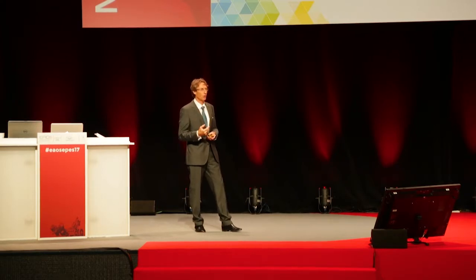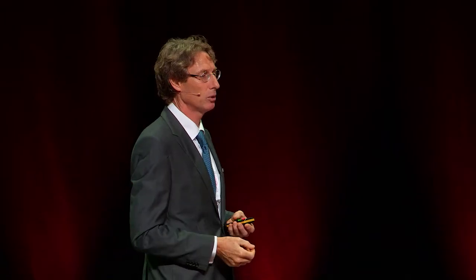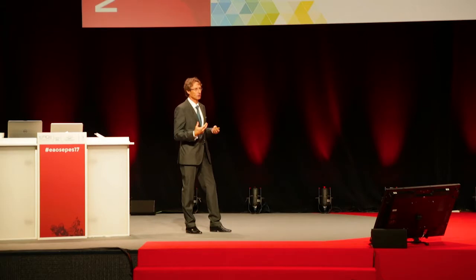We like it because the prosthesis can adjust to the function. But what you don't want to have is this wear here with the red line, because it's too much. And what we will see two years afterwards is that the veneer will fracture because the occlusion forces change. We saw that in other works. And in literature we always see works done recently, but all the works we take out of the patient's mouth that have some years in usage are not so nice.